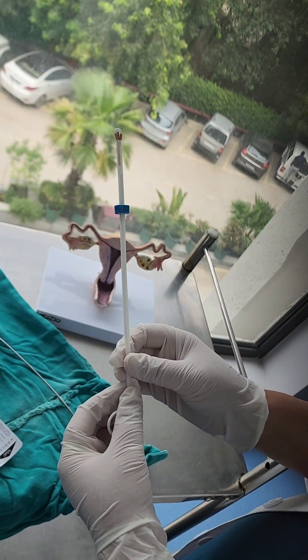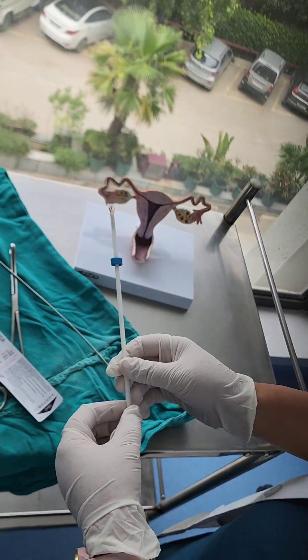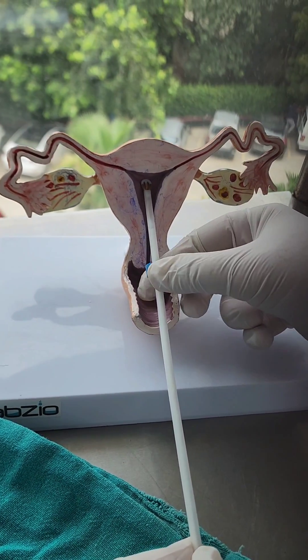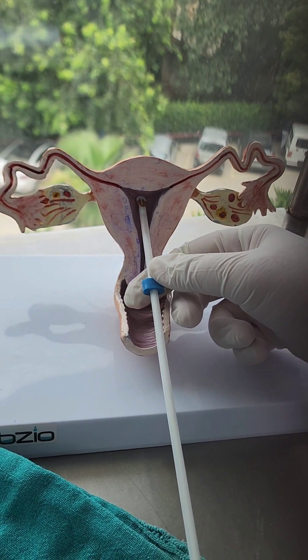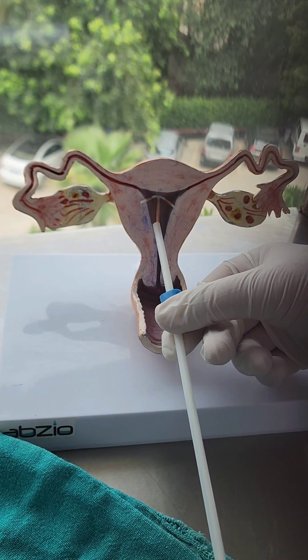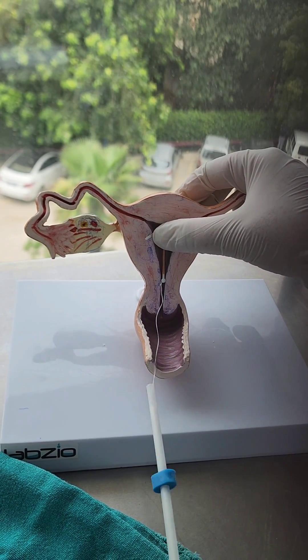The technique of insertion is called the withdrawal technique, and this is important to prevent perforation of the uterus. We introduce the copper T inside the uterine cavity, and because the length has been adjusted prior, we simply withdraw the inserter over the plunger so that the arms get released within the uterine cavity. Then we take out both the plunger and inserter together.